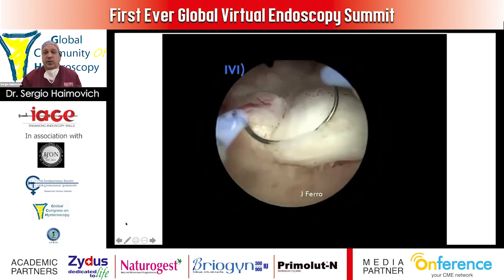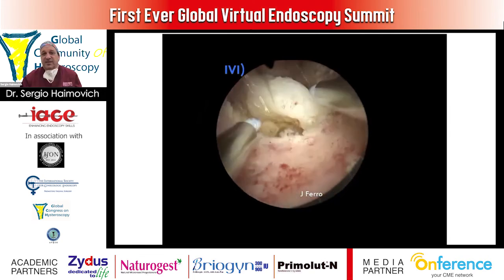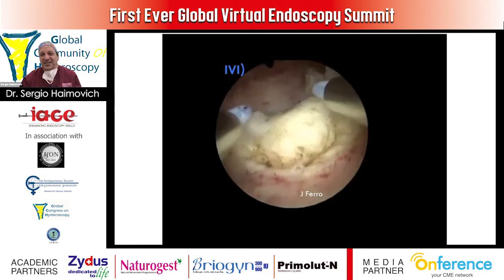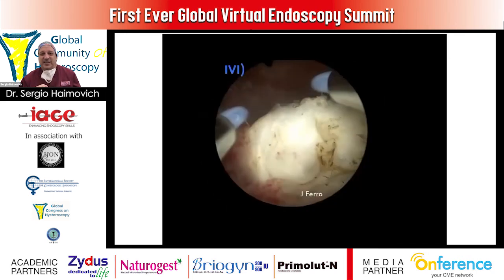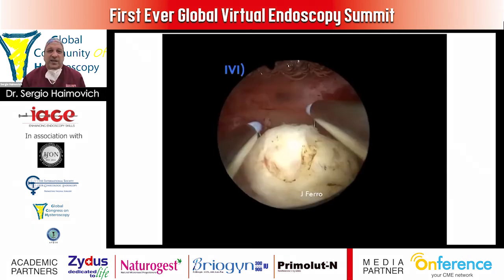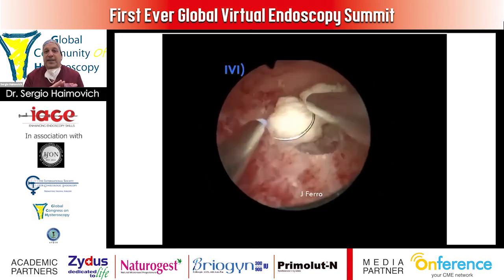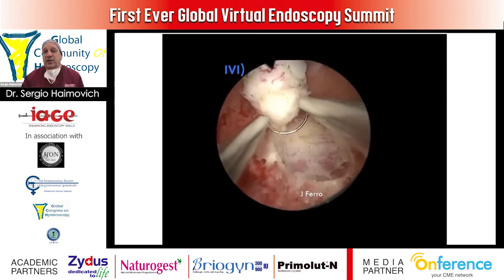He's moving the intramural part. Look, detaching it. I want you to see the fovea inside the wall of the cavity of the uterus when he finished. This is the end. Now he will detach it completely. And now you got it. So you see the fovea, and the fovea is respecting the myometrium. That's the important part of it, especially from the reproductive point of view. You respect the myometrium, no scars in the myometrium.